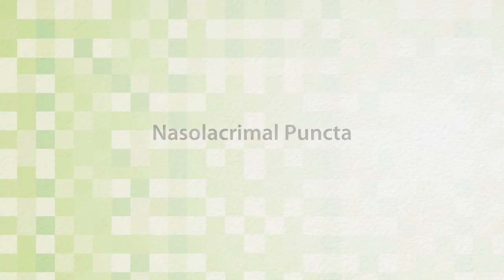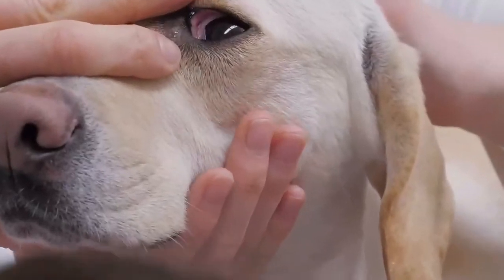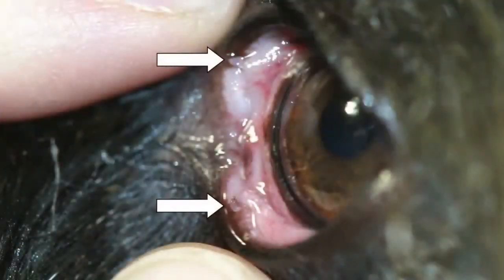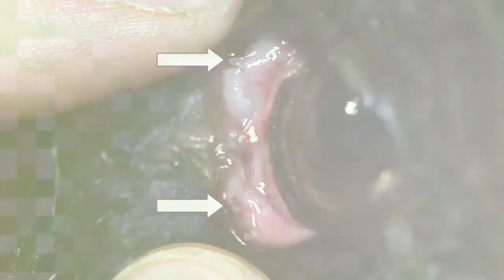Nasolacrimal puncta. Examine the dorsal and ventral puncta in the palpebral conjunctiva. These are located approximately 2 millimeters lateral to the medial canthus. Loupe magnification is helpful for examination of the puncta. In some animals, a small amount of pigment along the margins of the puncta will facilitate identification.